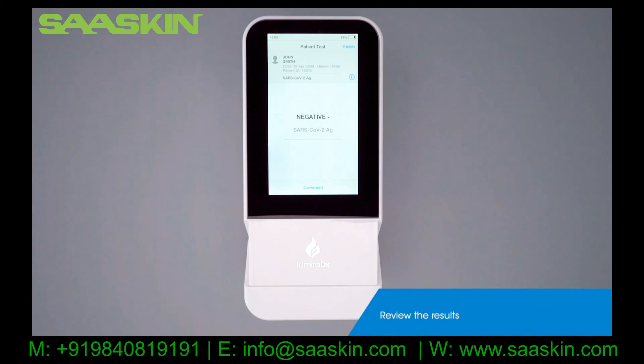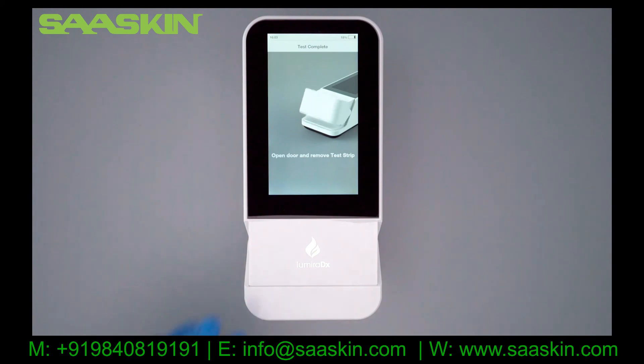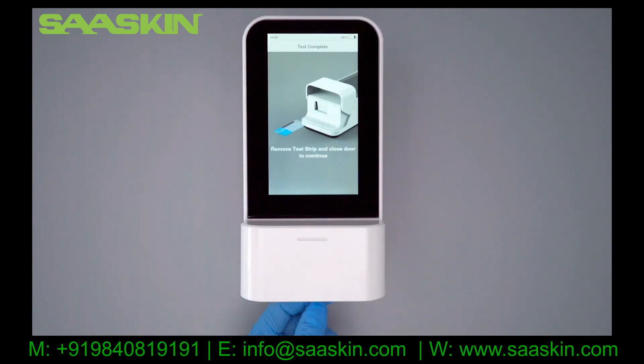Once the test is completed, the results will display on the screen. Tap Finish to complete the test. Follow the instructions to remove the test strip and close the door. Tap Finish.